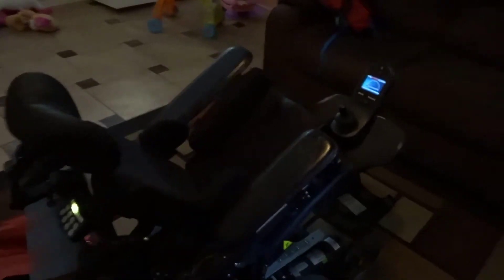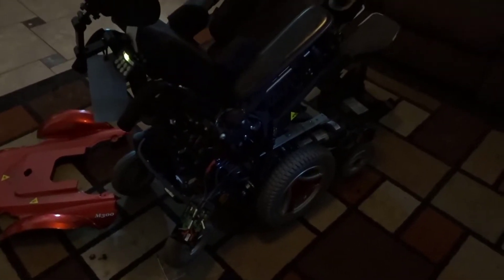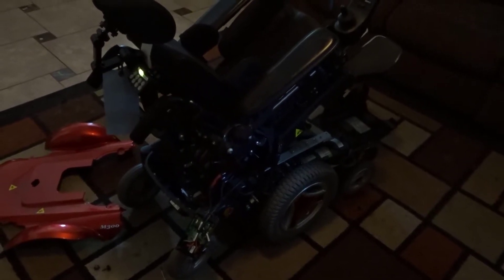I was doing a search for these chairs being stuck in turtle mode. You see quite a few people on the internet searching for it, going to the New Motion Facebook page saying the chair is stuck in turtle mode, and they just get told to contact service.